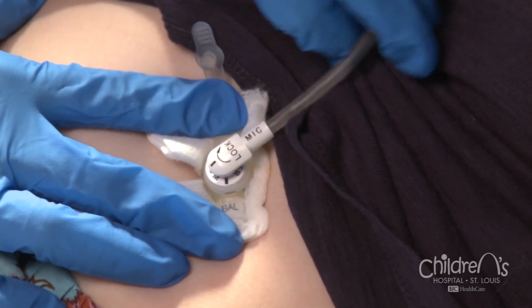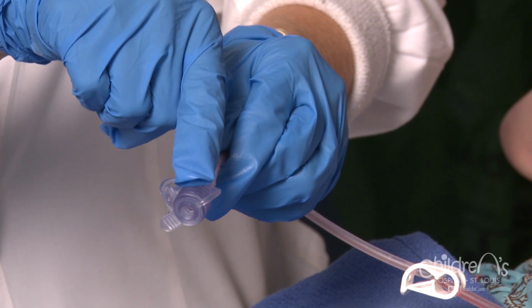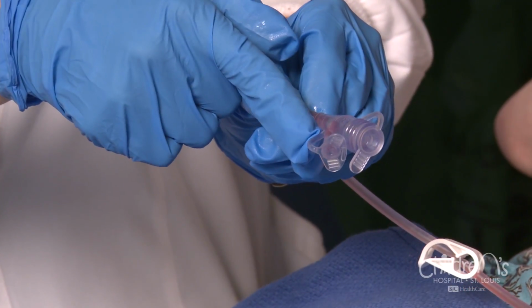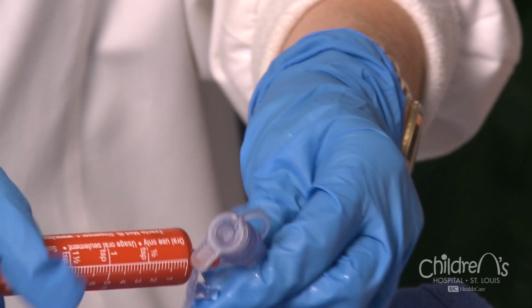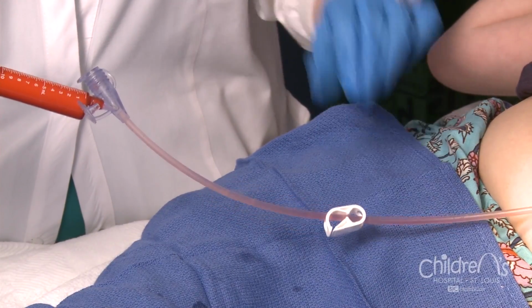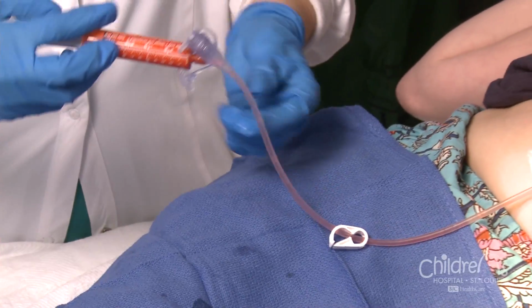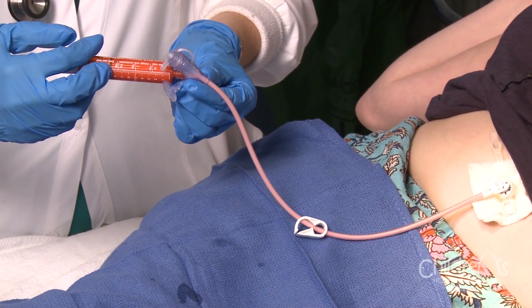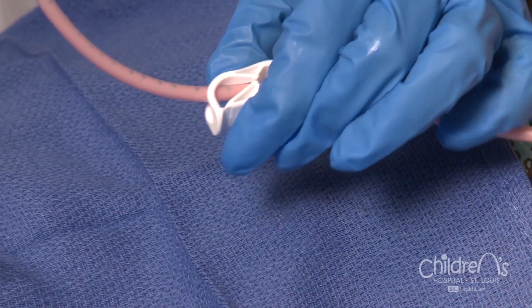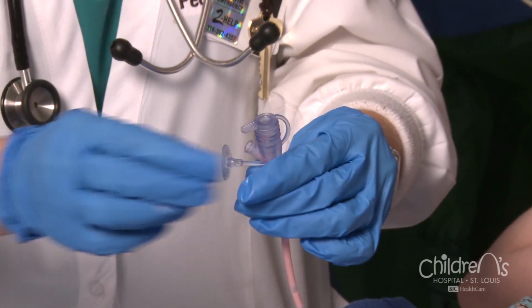Connect the extension set to the button as previously instructed. Be sure the feeding port is closed when using the medicine port. Put the medicine syringe into the smaller port. Unclamp the extension set and slowly push the medicine into the button. Clamp the extension set, then disconnect the medicine syringe and close the med port on the extension set.